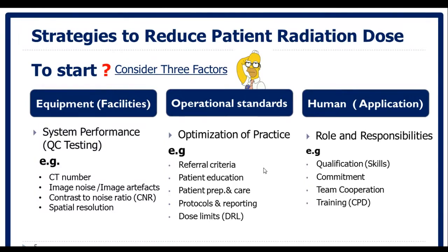Are there any established diagnostic reference levels? Is there any variation in the dose? What are the requirements to avoid these variations?